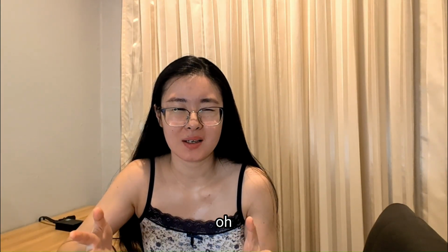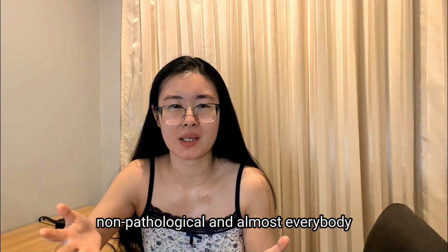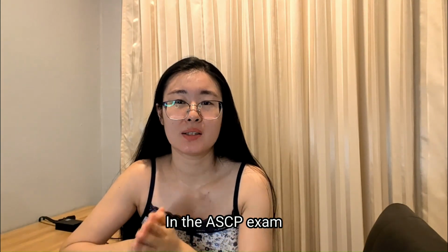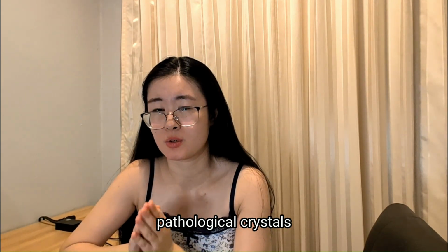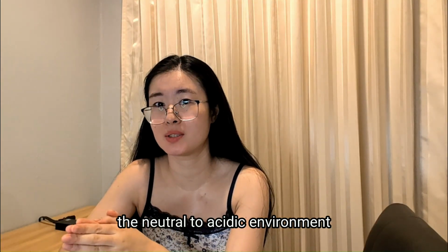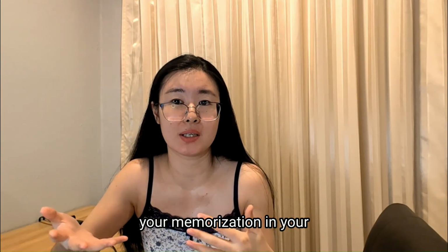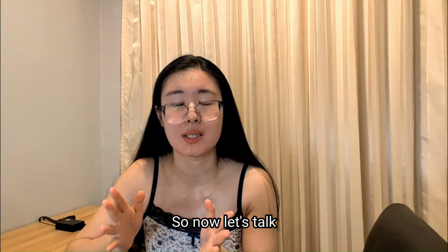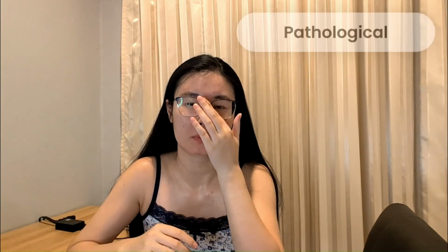And now you might be thinking, oh, all of these are non-pathological and almost everybody is alkaline. And yes, your feeling is valid. In the ASCP exam, the primary metabolic pathological crystals are all in the neutral to acidic environment, which is great because now you can simplify your memorization in your exam and get your points easier, right? So now let's talk about what are these pathological ones you need to pay attention to.